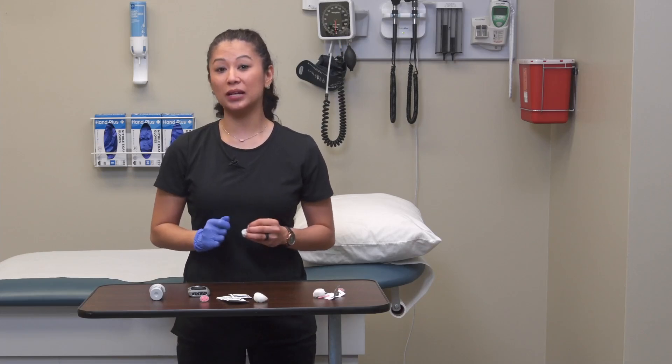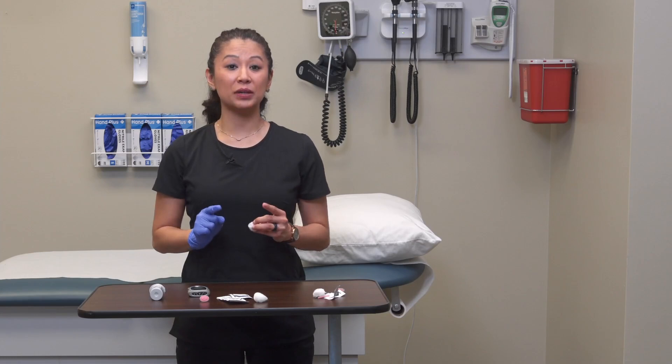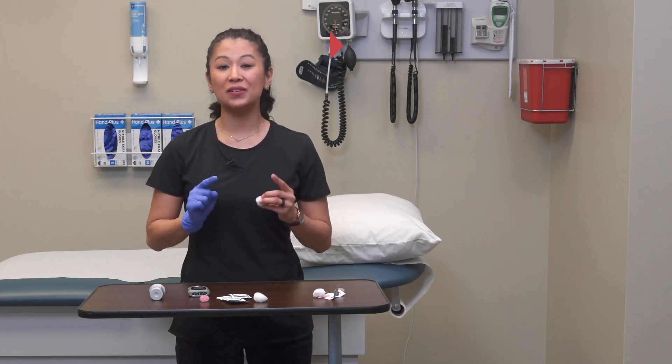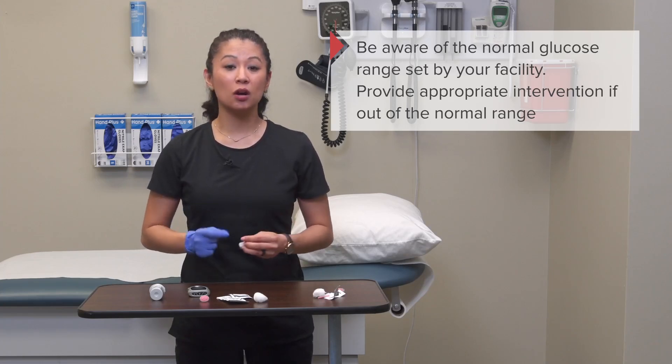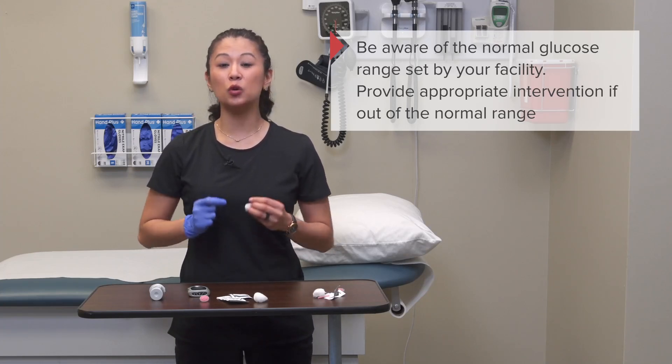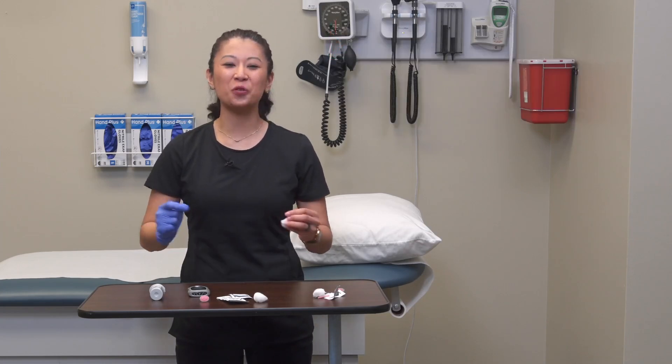An important final point: know your facility's normal glucose ranges. If the result is out of range, this may warrant contacting the nurse, or if you are the nurse, look at the results to determine if they need prompt attention.